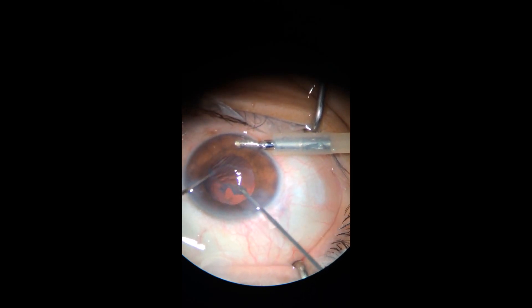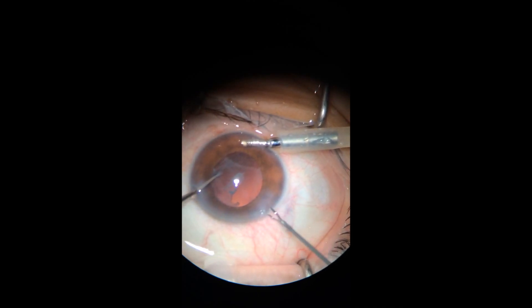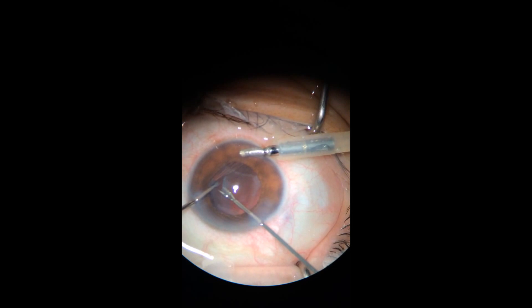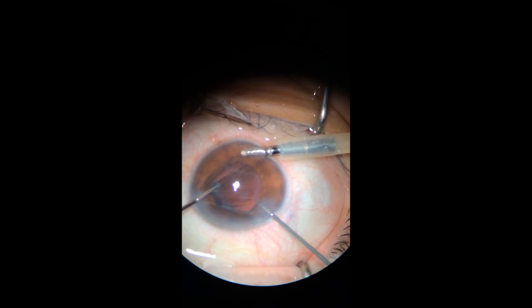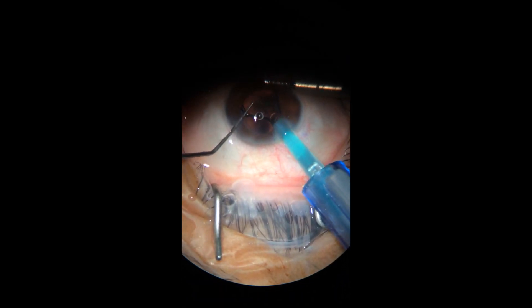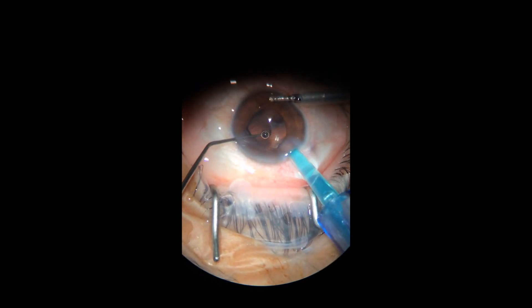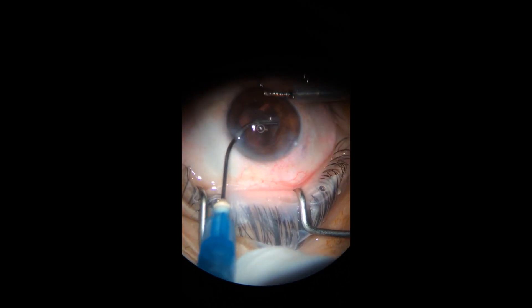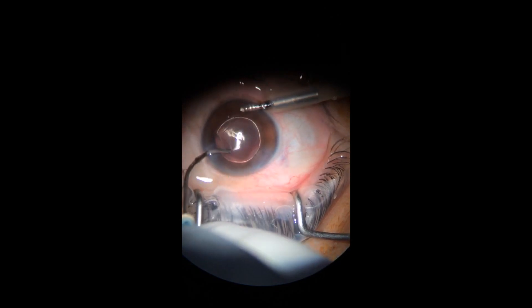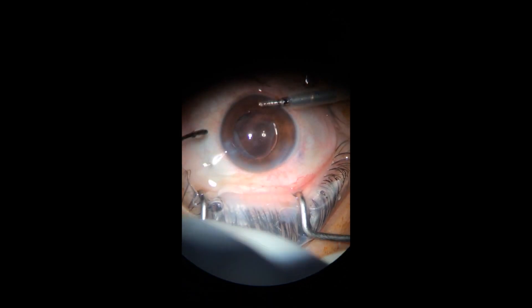It was a tricky way to take that off but finally I was able to do it. It was a very elastic and very rubbery type of tissue. I introduced the IOL in the bag. Initially I wanted to address the posterior membrane fibrosis with the vitreous cutter, but I decided it would be better to take it out with YAG laser later on.